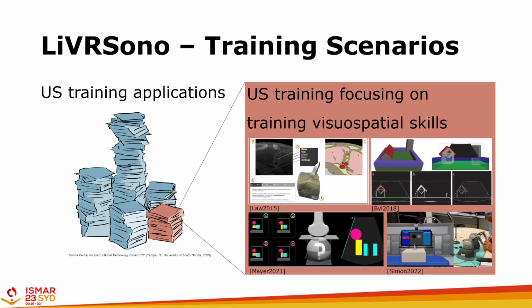There are also several training applications in various medical areas, however most of them do not focus on the visual spatial skills, and those which do so are either desktop-based or use simple geometric scenes. Because of this, we want to make sure that the real situation regarding hand-eye coordination is given in the VR environment, and we aimed at identifying relevant training scenarios for visual spatial skills that are also medically relevant.